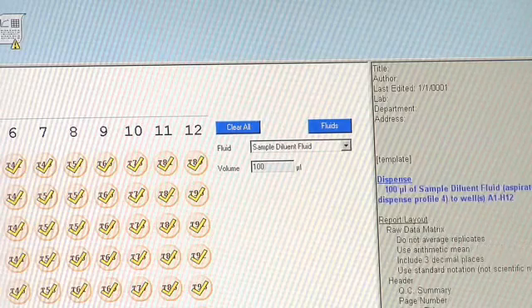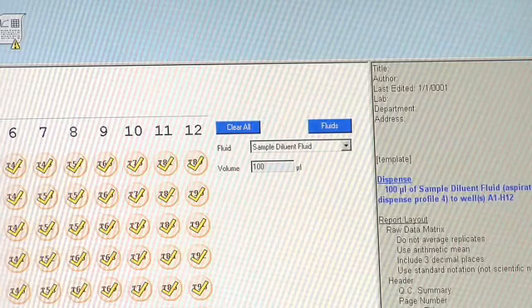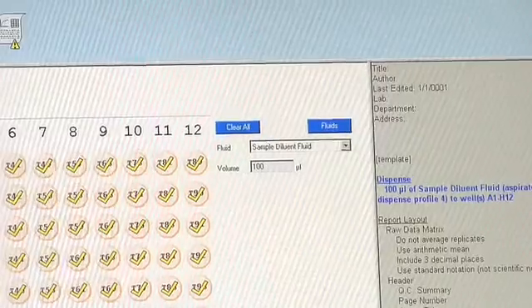The assay writer also creates a text description of your assay, which you can print out as documentation for QC, regulatory, troubleshooting, or training purposes.